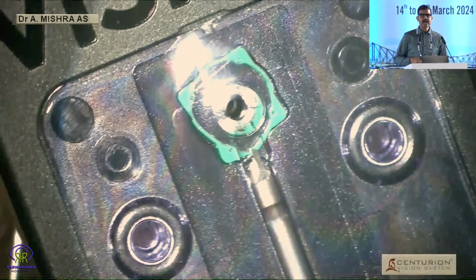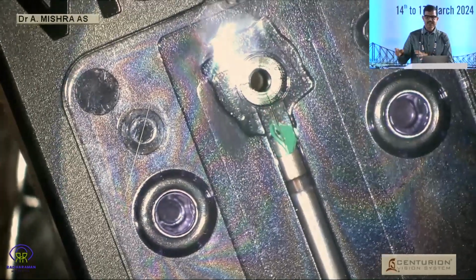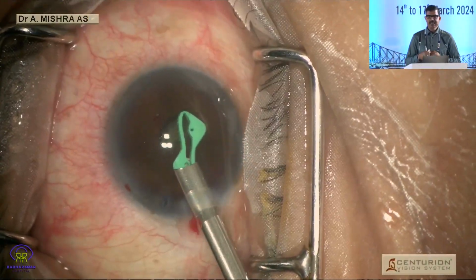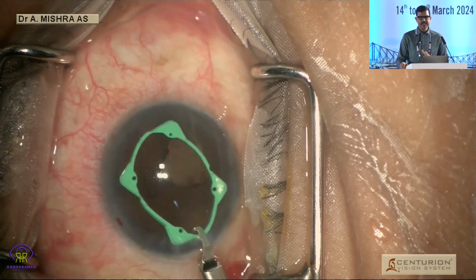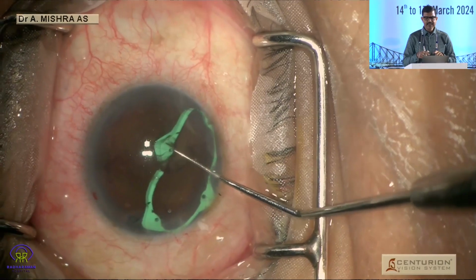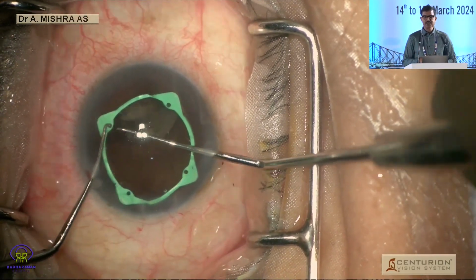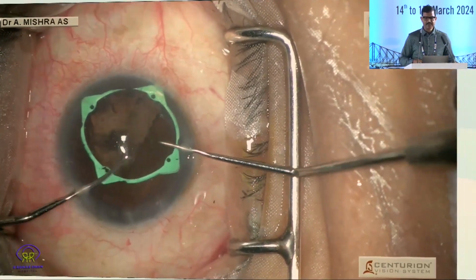This is the Visitech eye ring, which has come up recently, and the material here is polyurethane, which is a much softer material. Just like the Mulligan, it needs to be pulled into the plunger first, and then it has to be delivered into the anterior chamber. And then after it is delivered, one by one, all the angles can be engaged. The advantage that I found with this is that it maintains a more circular pupil than the other devices. So the shape of the pupil is more circular, and after its removal also the pupil somehow maintains its circularity.